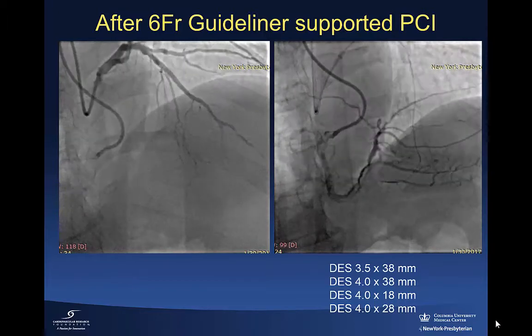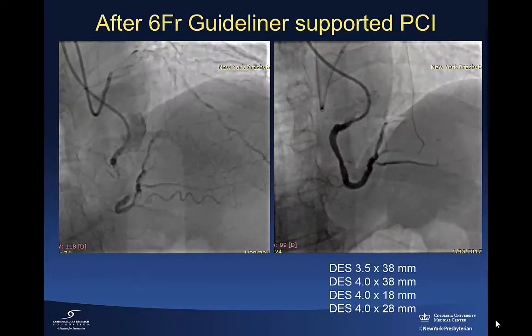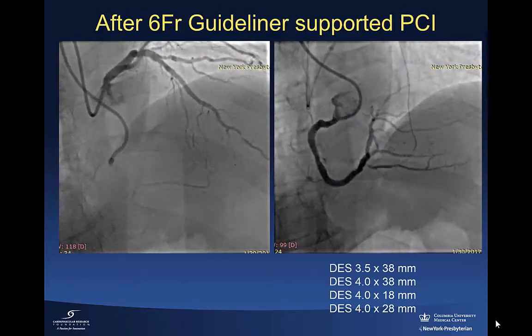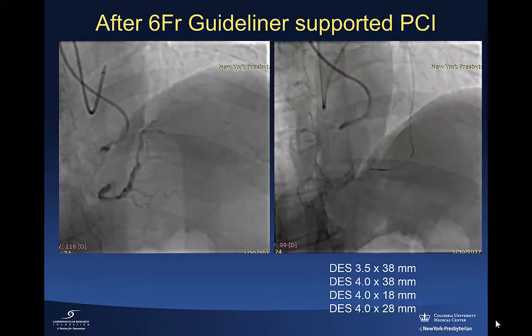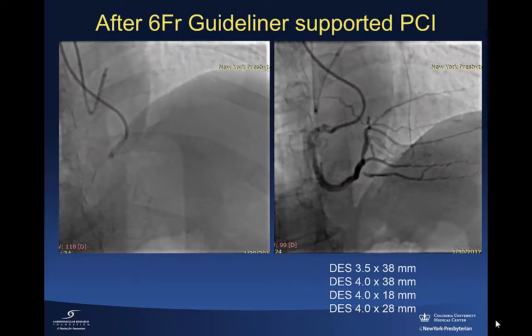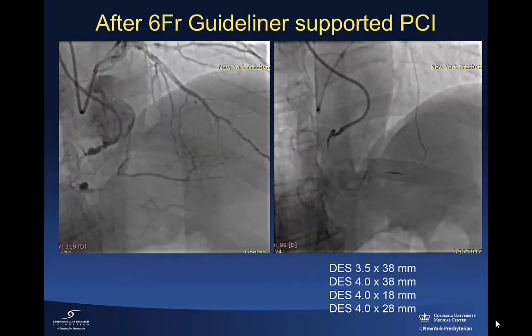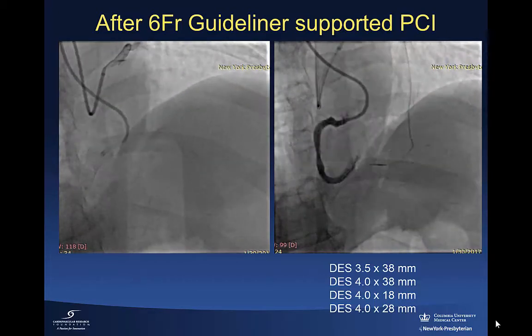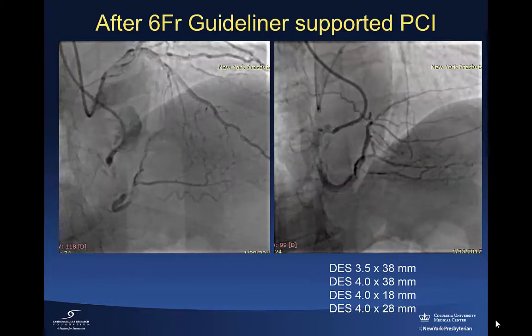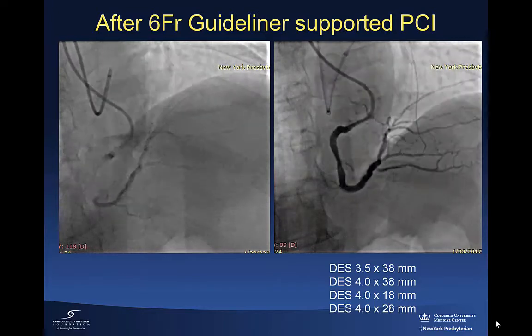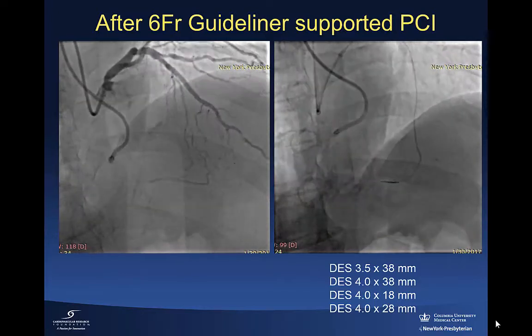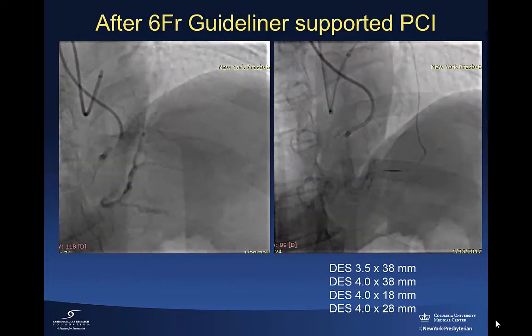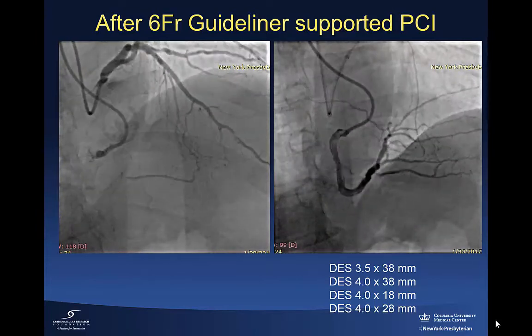Another point — I like your point about the calcification. We've had some perforations in the past when going very aggressive in those calcified vessels. So it looks like for those, you just accept a less perfect angiographic result to minimize the risk of complications. Absolutely. The enemy of good is better. If you have adequate MLA and MSA by IVUS, people should resist the temptation of going for a perfect result. In this situation it's very difficult to dilate because if you've pushed the calcium towards one side, you're essentially just dilating the adventitia and it recoils. So you have a risk of perforation by pushing a spicule of calcium outside the vessel without really accomplishing much with higher pressures.